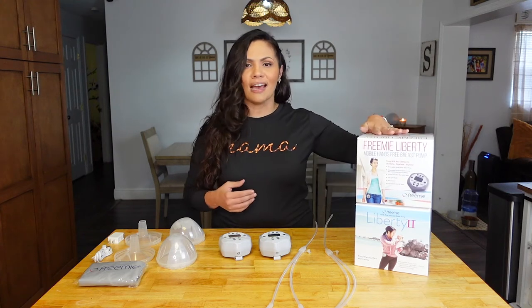The Liberty 1 pump has been discontinued, so you will no longer be able to purchase it on the market. However, the parts to it are still available. So if you want to purchase those, you can do so on the FreeMie website, but it would only be the pieces, not the pump.